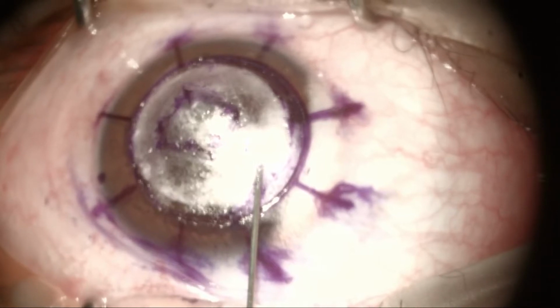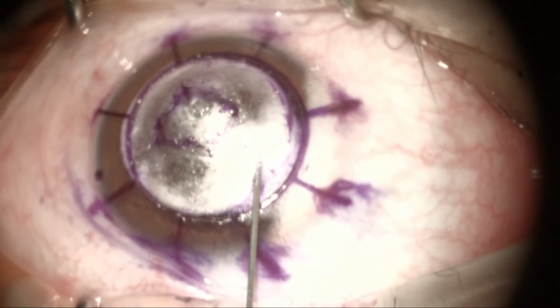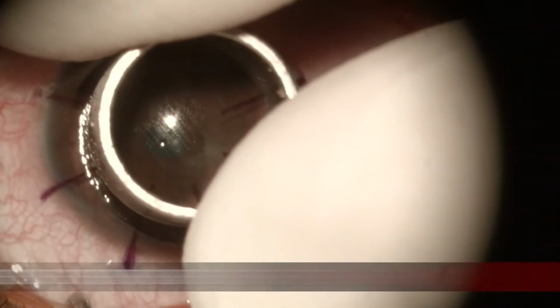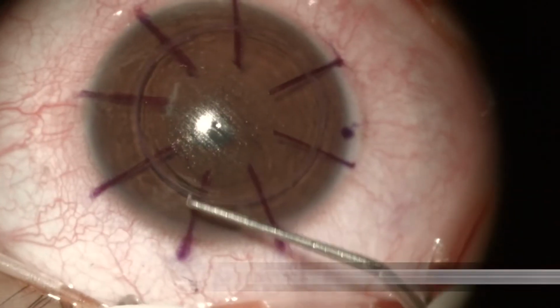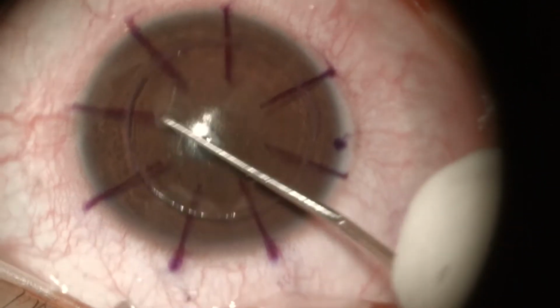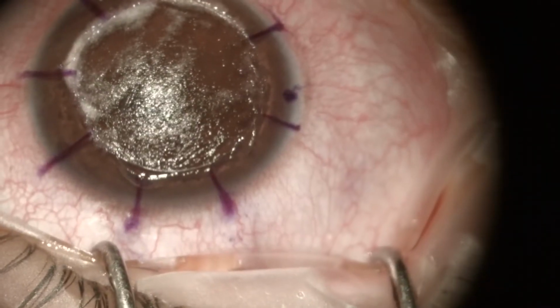Several modifications to the original technique have been introduced to simplify the procedure. Some of them are: the trephination is performed superficially, not more than 50% of the total thickness. We check the depth of the trephination with an iris hook. The first keratectomy is then performed superficially and previous to the air injection. This gives us a better control over the plane we want to inject the air.